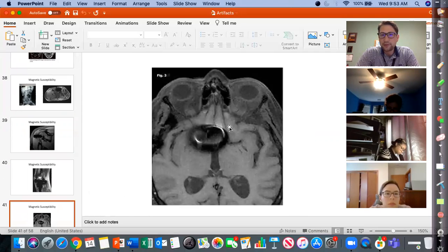Here's a possible aneurysm clip. So you'd be really scared if you didn't know the patient had this, and then now they're in the scanner. Now you need to think about, oh my God, how do I get the patient out without hurting them? And sometimes the best thing to do is call your MRSO, your safety officer, because the best thing to do is sometimes not what you would think. And in a scenario like this, sometimes you move the patient out, but you move them out very slowly so it doesn't rotate that aneurysm clip and burst that vessel.